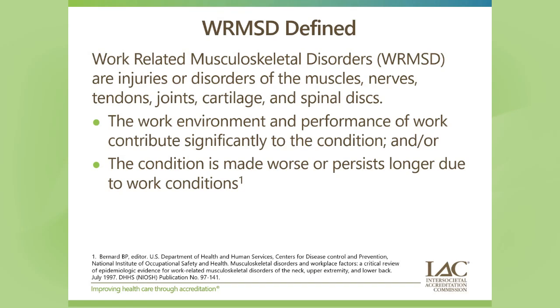And so that is our definition of these work-related musculoskeletal disorders. And so we need to think through our day, and do I have pain when I'm scanning, and where is that pain, and what can I do about trying to minimize that?